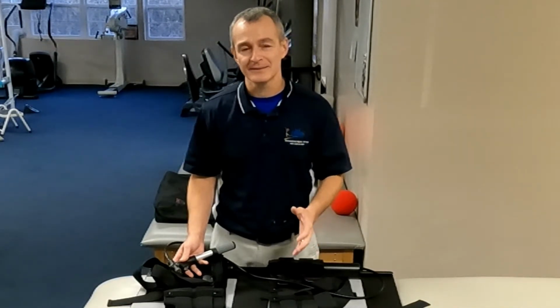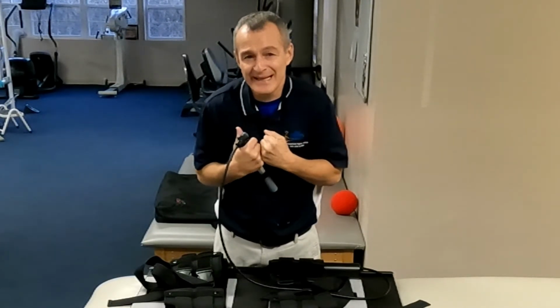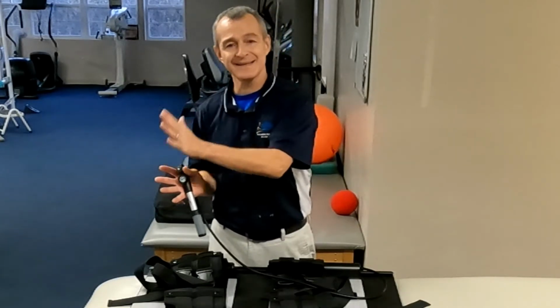It just makes things a little easier, gives me some objective measures with the dial and the gauge so I can see exactly how much pressure I'm applying. And the whole goal here is gentle pressure. If I can get the body to relax, if I can get the muscles around the spine to relax, I will produce more distraction, more space between the vertebral bodies than if I try to overcome and really stretch the body apart. We know from clinical research that if we pull on the spine, the paraspinal muscles will just tighten. So we call this the Goldilocks effect. Too little doesn't do anything. Too much has the opposite effect. It's harmful. We want to find just right.